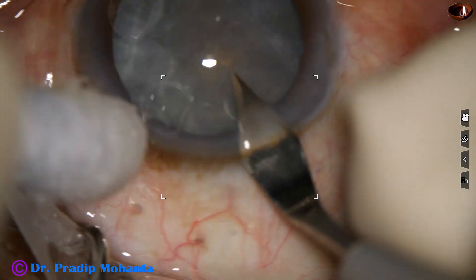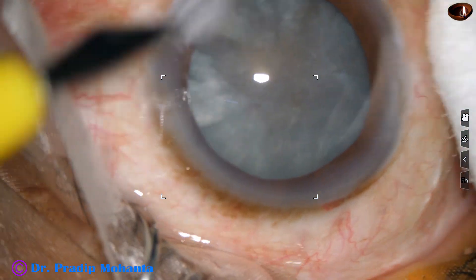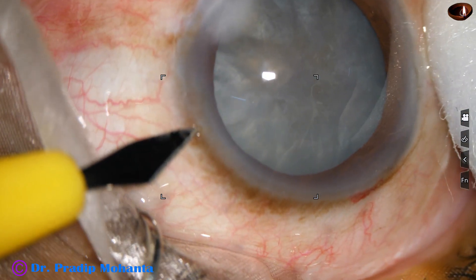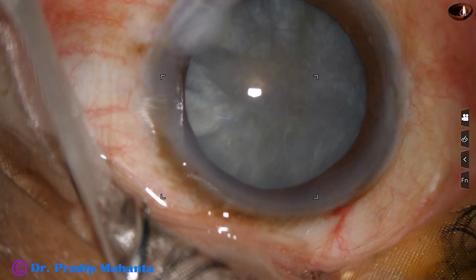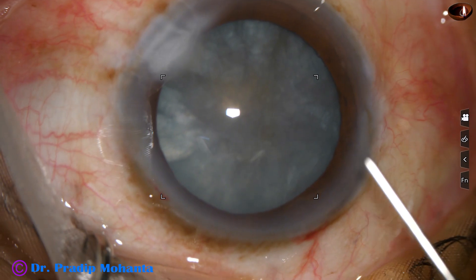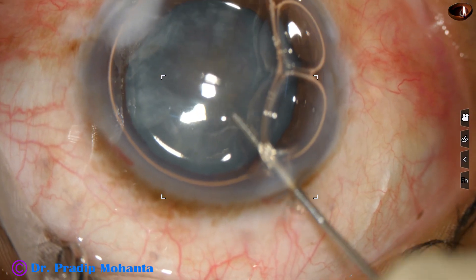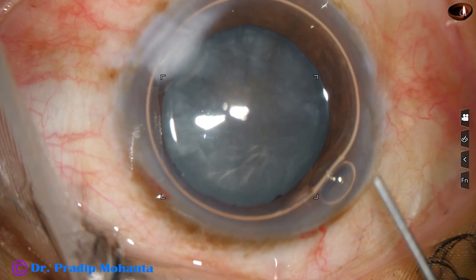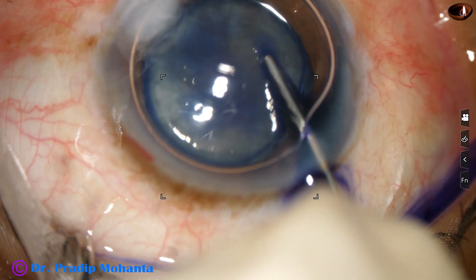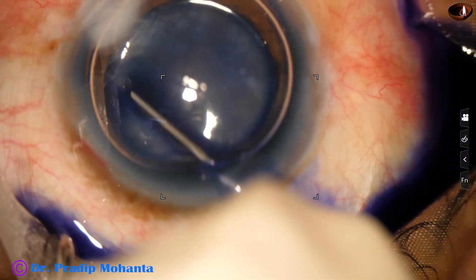This is the main incision with a 2.8 mm steel keratome, and this is a side port on the left side of the main incision, about 3 o'clock hours away from the main incision. An air bubble is injected to fill out the anterior chamber. Underneath this air bubble, over the anterior capsule, trypan blue dye is applied to get contrast during capsulorhexis.